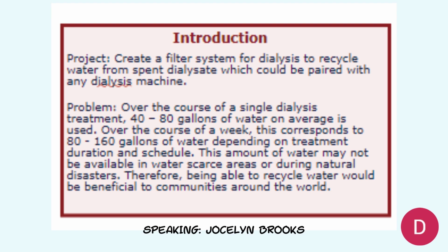For example, our aim is to have somebody undergoing dialysis hook up to a sink, like is done during normal dialysis. They turn on the water, and then once our storage bags are filled up with an appropriate amount of water to complete a full dialysis treatment, the water from the sink is shut off, and the spent dialysate, and therefore the recycled water, is continuously recycled throughout the entire treatment. Our hope is to cut down the amount of water to about 6 gallons.